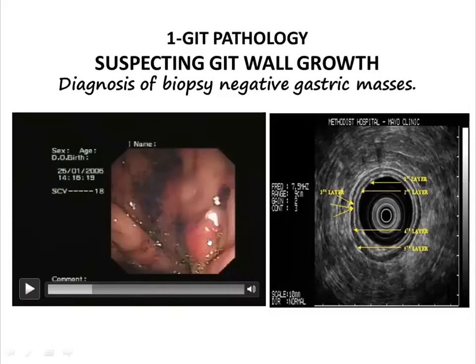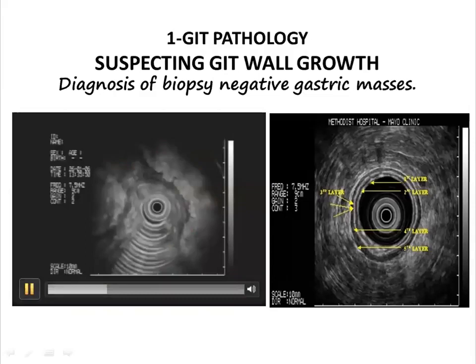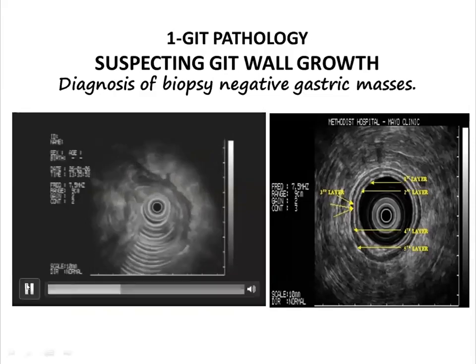But endoscopic biopsies with the usual forceps, sometimes and frequently in up to 50% of cases of adenocarcinoma or lymphoma, especially lymphoma, come back inconclusive, just an inflammatory lesion. Many of these cases were referred for endoscopic ultrasound to have an idea about the wall thickness and regularity.